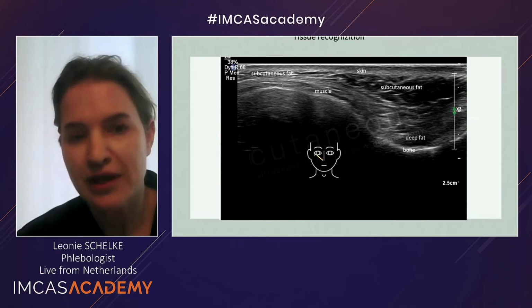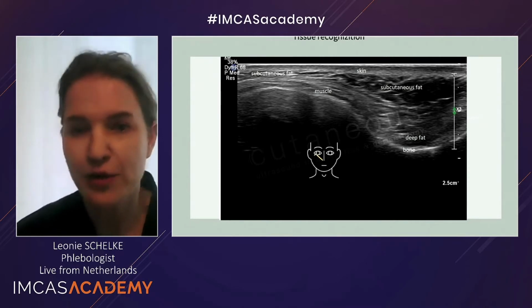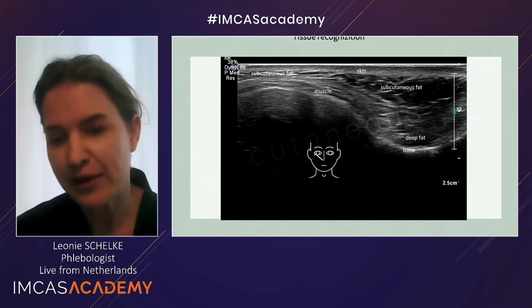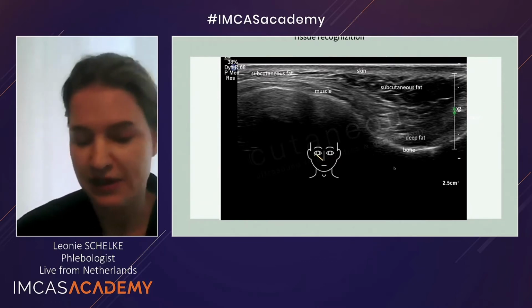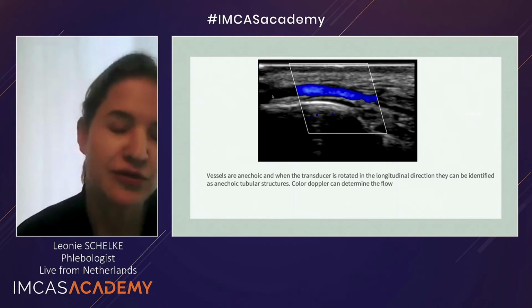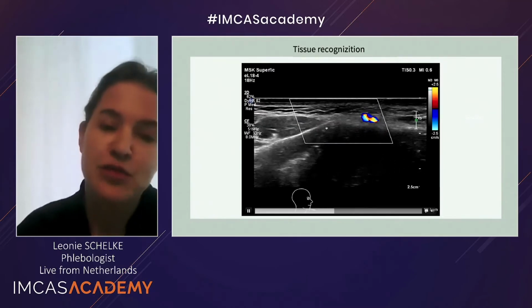And what you also see is it's not one layer, it is a layer, but it's an orange sliced form. So it differs in thickness, which is important for you to know if you start to inject. Here we have the deep fat pad, and again, the white layer is bone, the maxilla bone, but here we have the zygomatic bone. And of course, you can see vessels. So vessels are black because they contain fluid, but if you put the color box on, you will appreciate that they're blue or red. Not as in your color box, but it's more the movement of the transducer.